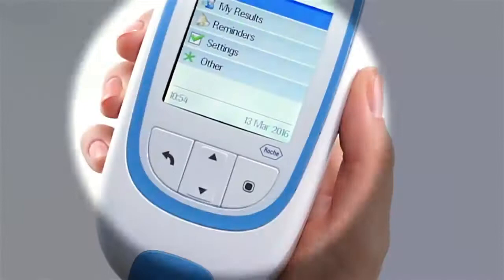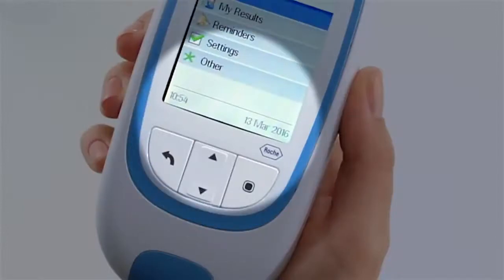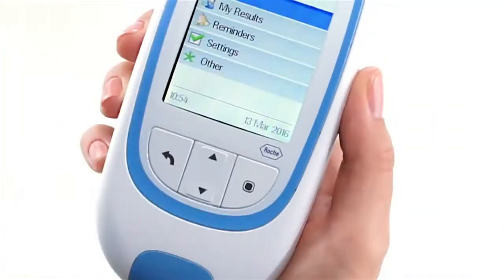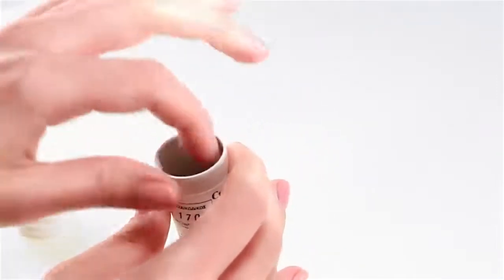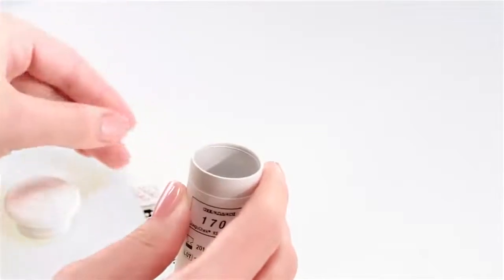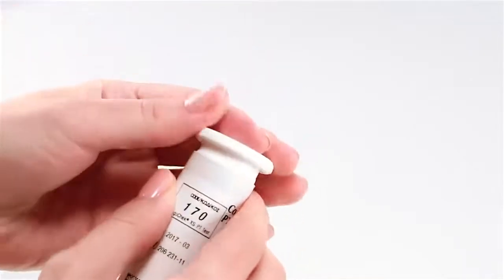Check that the time and date are correct. If necessary, reset the time and date. Take a test strip from the container. Always remember to immediately put the lid back on — this will prevent the strips from deteriorating.